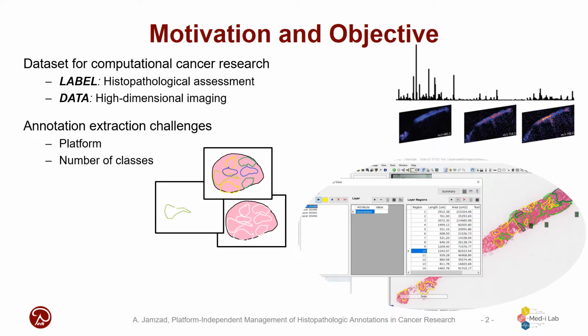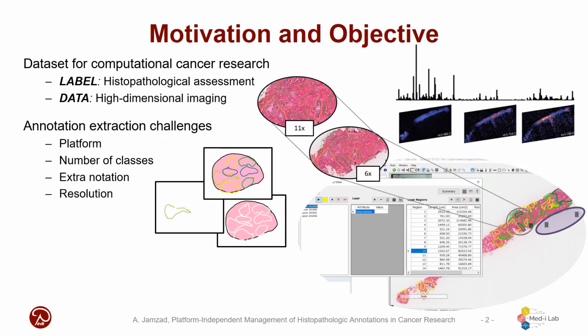Traditional image processing applied to the snapshot of tissue annotation overlay limits the number of differentiable classes, which is particularly needed for heterogeneous tissues like prostate. It also ignores extra comments added during annotation, and the spatial resolution is limited to the snapshot region.